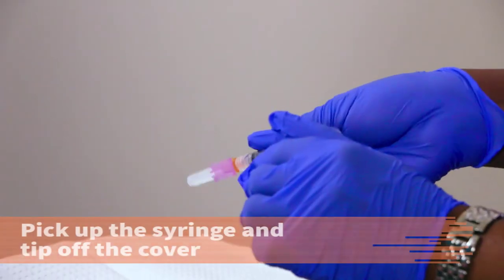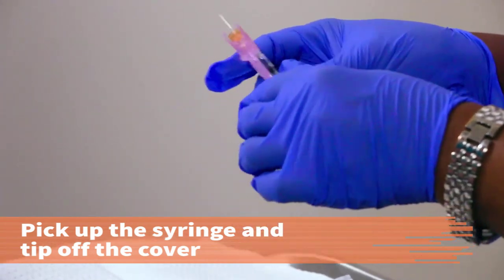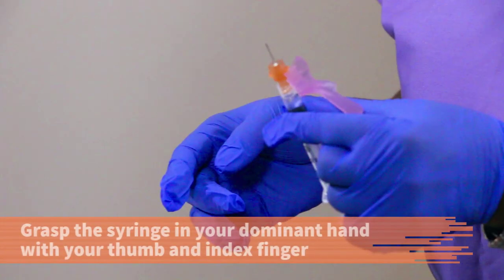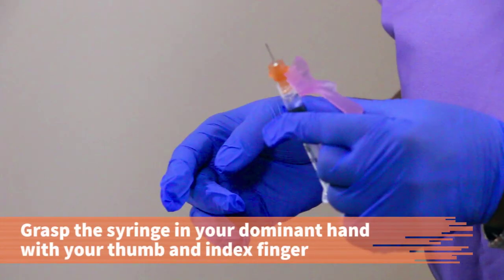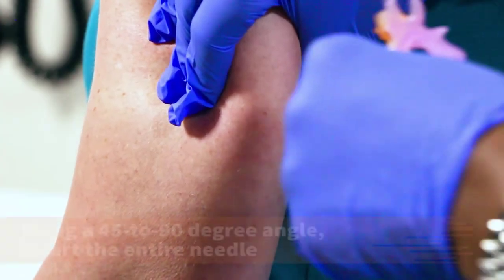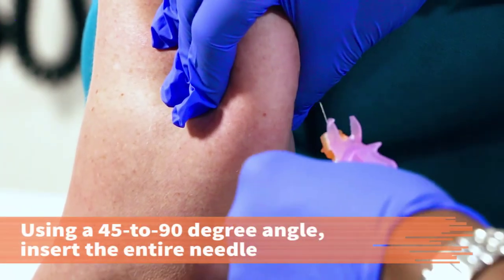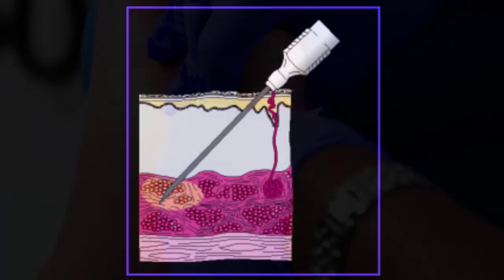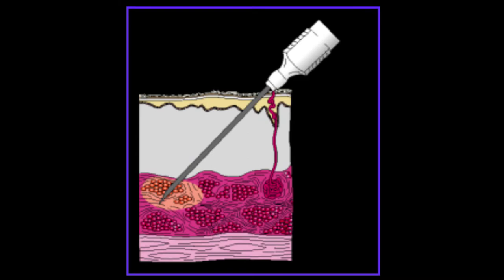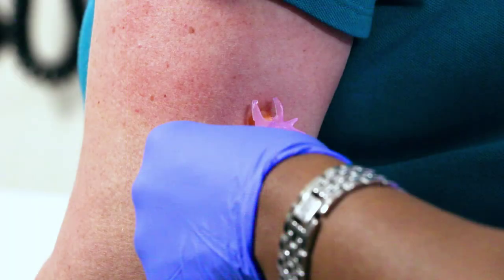Pick up the syringe and tip it to remove the cover. Grasp the syringe in your dominant hand using your thumb and index finger. Make sure to have no fingers under the syringe. Quickly and smoothly insert the needle into the site using a 45 or 90 degree angle depending on the needle size. Insert the entire needle.